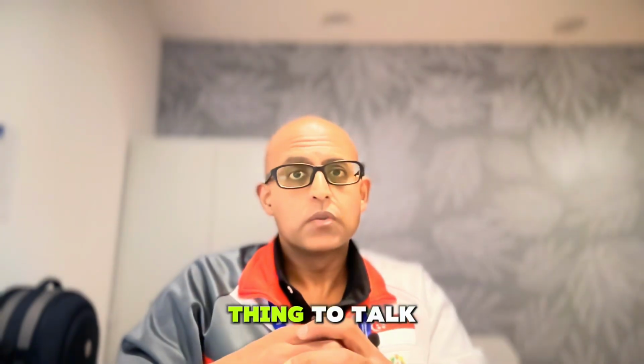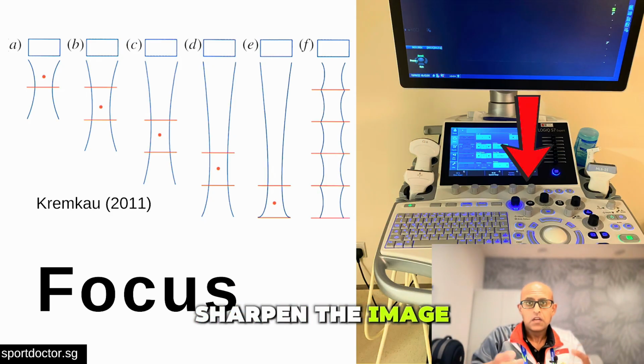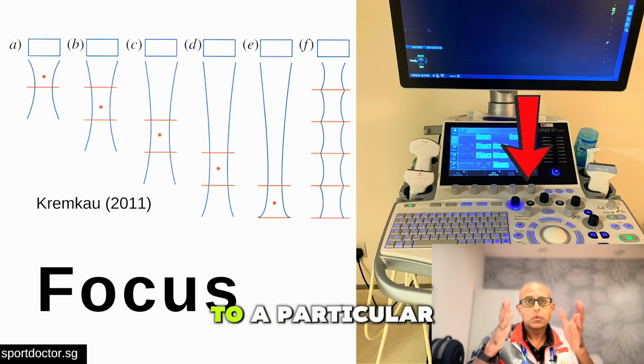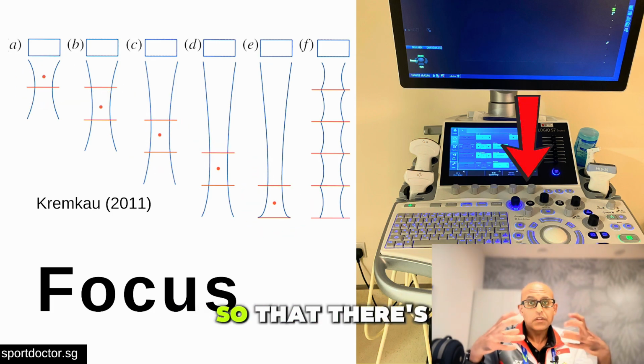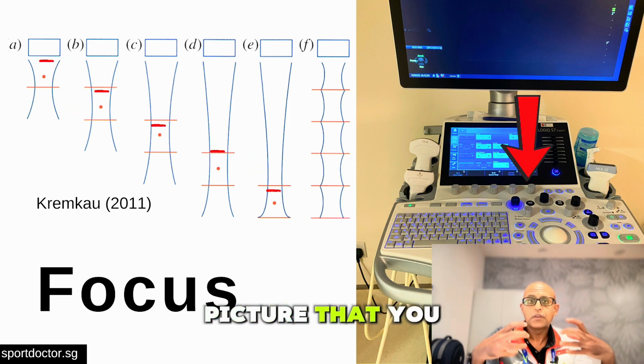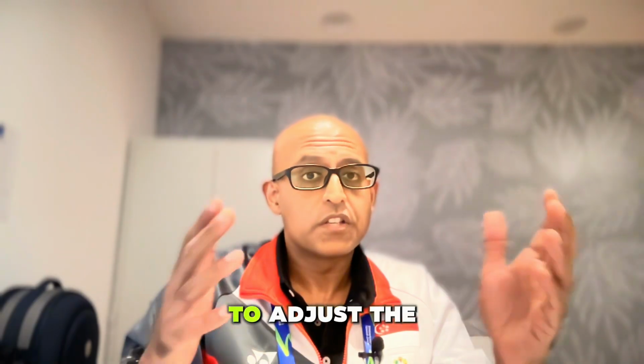The next important thing to talk about is the focus. Much like on a camera where you're trying to sharpen the image, in ultrasound, what you're doing is you're trying to concentrate the waves to a particular area or structure so that there's more sound waves going into that area, and hence the picture that you get back is sharper. As the structure gets deeper, you may need to adjust the focus so that it follows it.